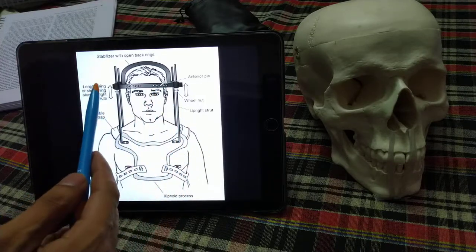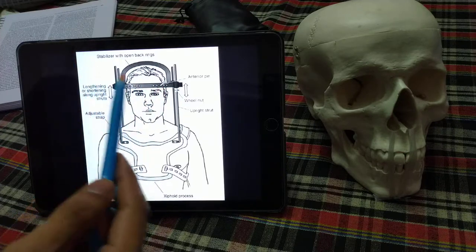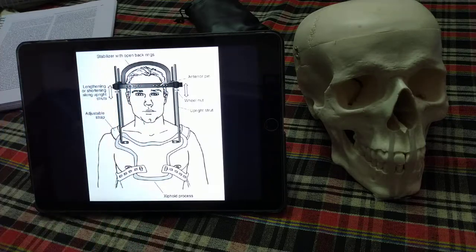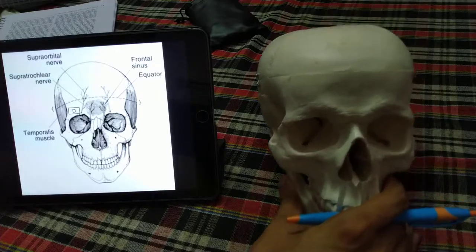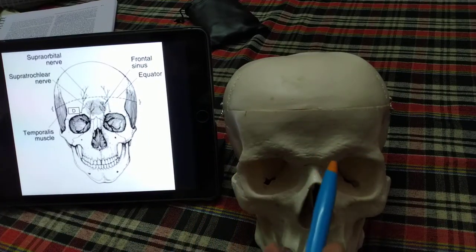Regarding the ring and pins in detail: the size of the ring is very important — it needs to be 1.5 to 2 centimeters larger than the head circumference, and no point of the ring should be in contact with the skin of the head. The pin position is very specific, with very little margin of error.